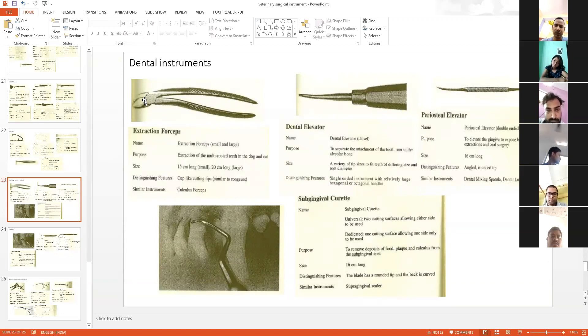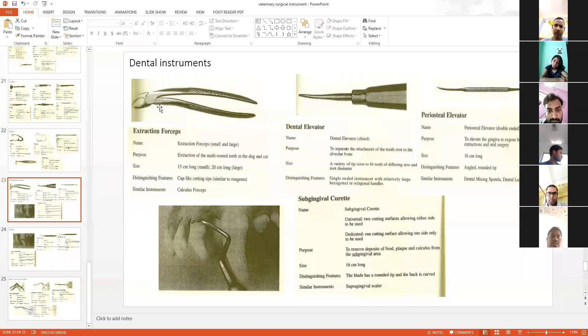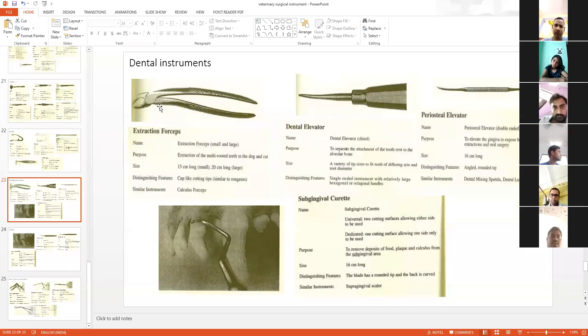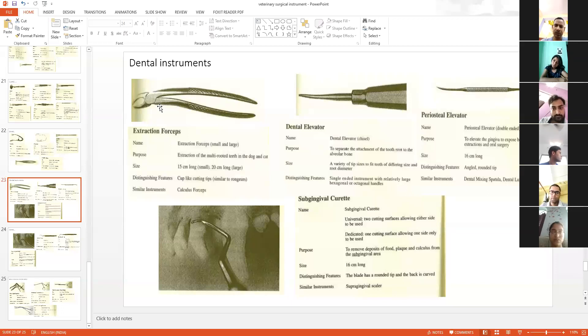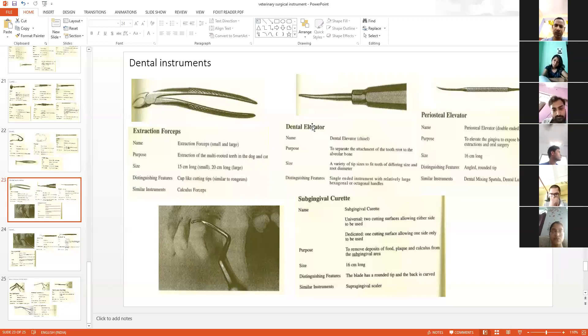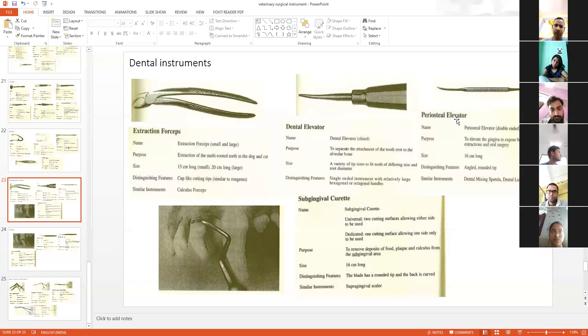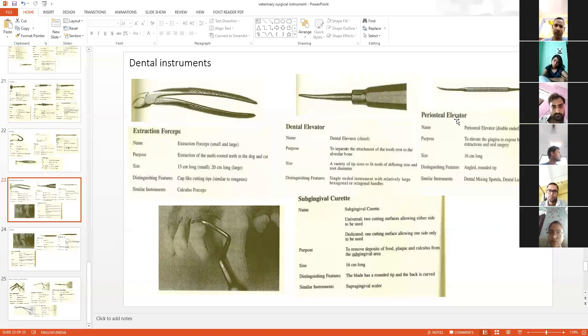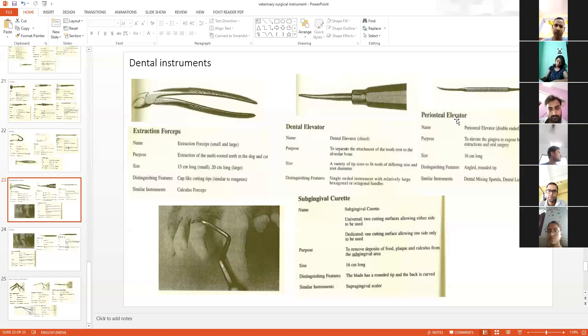This is a dental extraction forcep for molar tooth extraction. This is a dental elevator, also called a periosteal elevator. For teeth extraction, bone is also there, so this is used to elevate teeth and elevate bone.